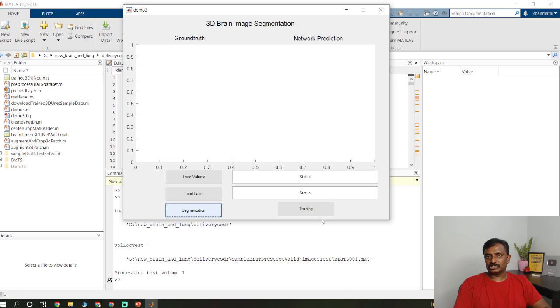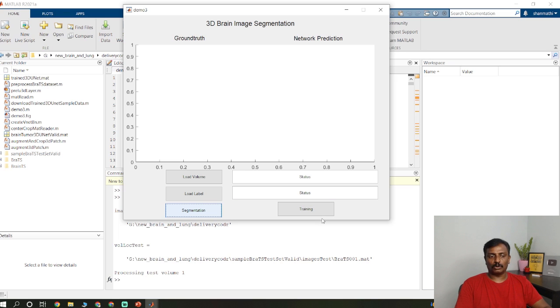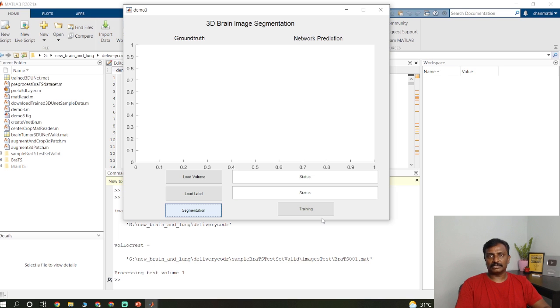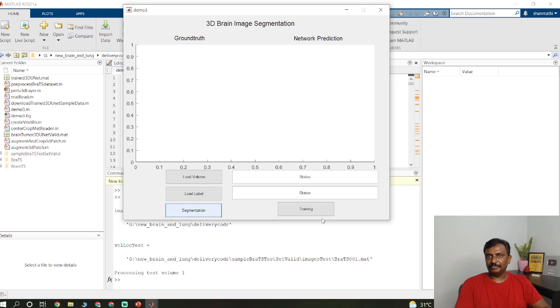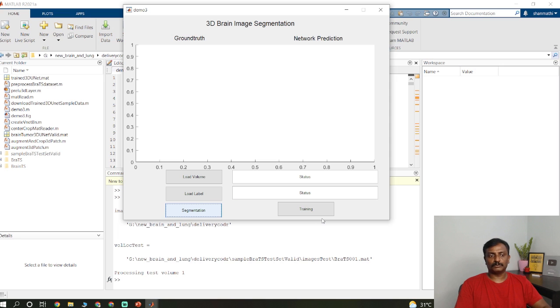If you could click training to train the network, it usually takes like 12 hours of time to train if you run on a GPU-based laptop. If you have a normal laptop, it will show you the memory error, out of memory error. So it is not possible to run on a normal 8GB RAM laptop. So it is recommended to have a GPU-based laptop to run the training process.